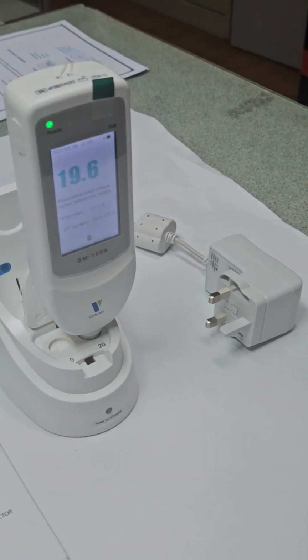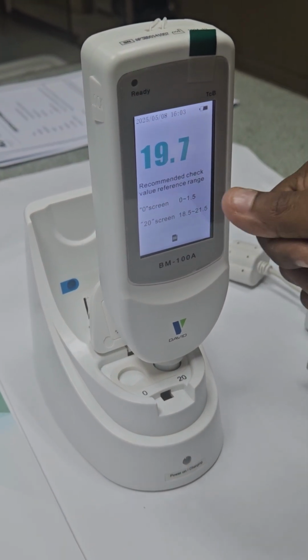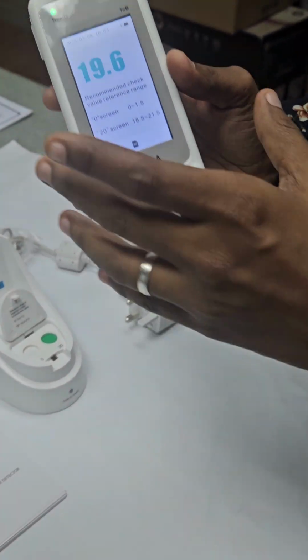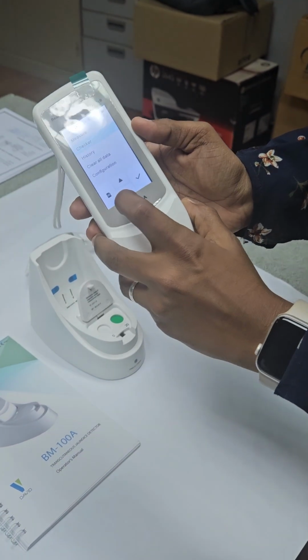Okay. So in the green screen, the 20 screen, the reading is within the range, 19.7. Okay. So it means that the machine is ready to be used. No need for any additional calibration or anything. It's good to go. Okay.